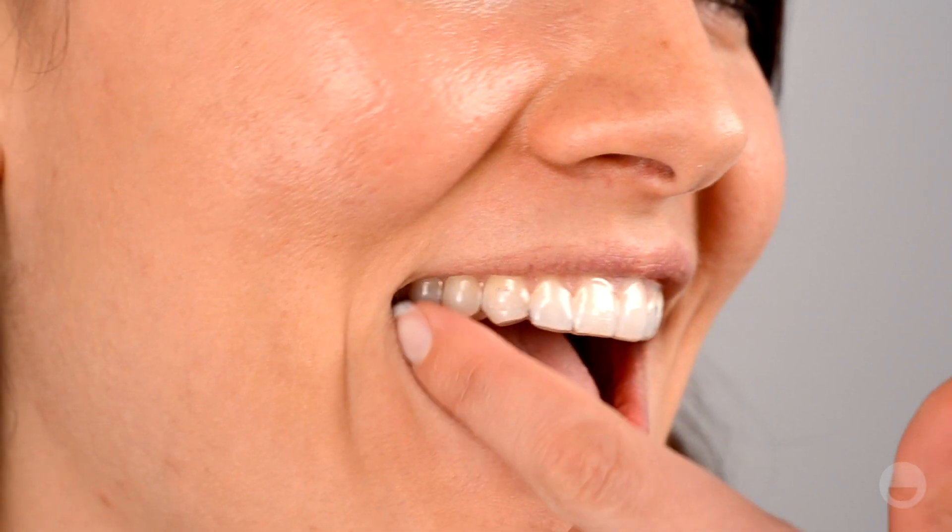Your patient should try on their new set of aligners at this point. Check the fit of the aligners to ensure that everything is seated properly. If you notice a gap between the aligner and the incisal edge of the tooth, check your treatment plan to see whether that tooth is extruding. If it is, that gap should close by the time your patient is done wearing that step.